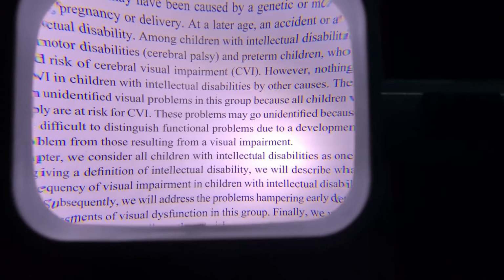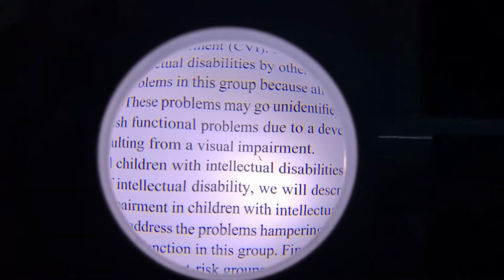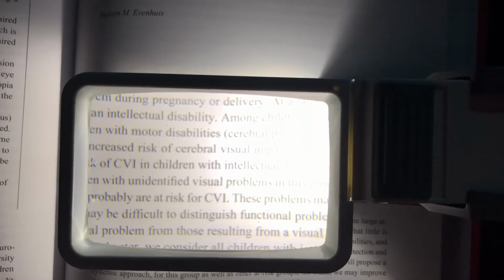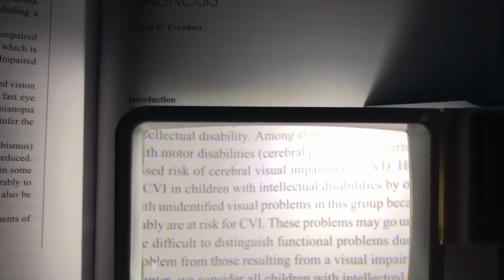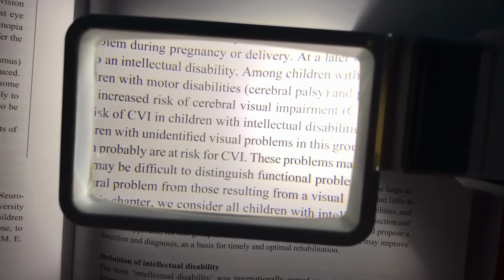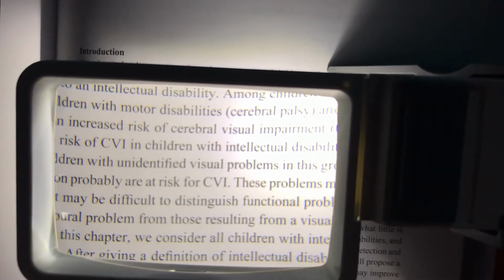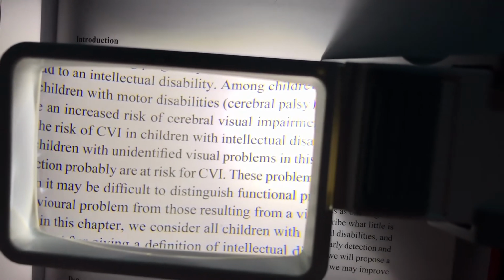This is the 3x Powermag. You can see that it is very bright and very even. That was true for both the 3x and now the 4x stand magnifiers. Now we compare the 3.5x Magno handheld, which is on a stand modifier, to see how it looks through the lens. You'll note that because there is no shroud, the light does go beyond just the viewing area. And you'll note that the light is a bit brighter towards the handle itself. So in the upper right-hand corner of the viewing area, it's a bit brighter. However, the light does get to the remainder of the text well.